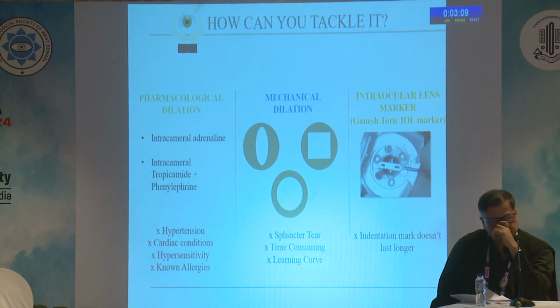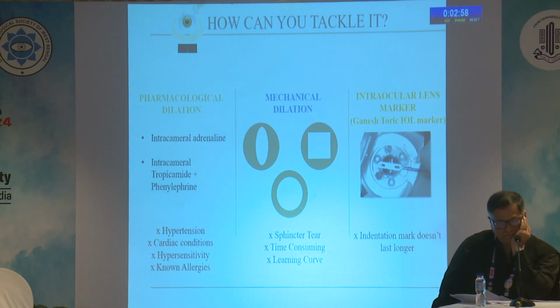This is a very good way to increase the pupil size, but intraoperatively, when you get a miotic pupil post-nucleus removal, it is really a time-consuming process, and it can result in sphincter tear, and it has a learning curve attached to it. And then there is this newly launched intraocular lens marker by Dr. Sri Ganesh. Again, a very good marker, but the indentation mark on the IOL does not stay longer.